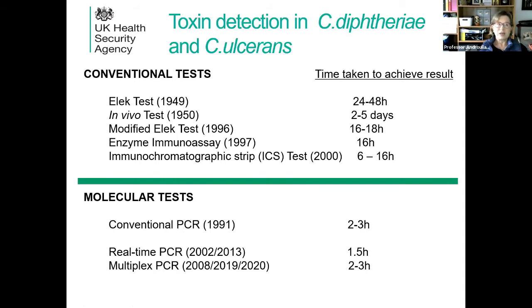This was done way back in 2000 with one of the US aid agencies called PATH, again in response to the epidemics in Europe. And this was an excellent test. A result was obtained within 6 to 16 hours, but unfortunately supplies diminished and nobody was interested.